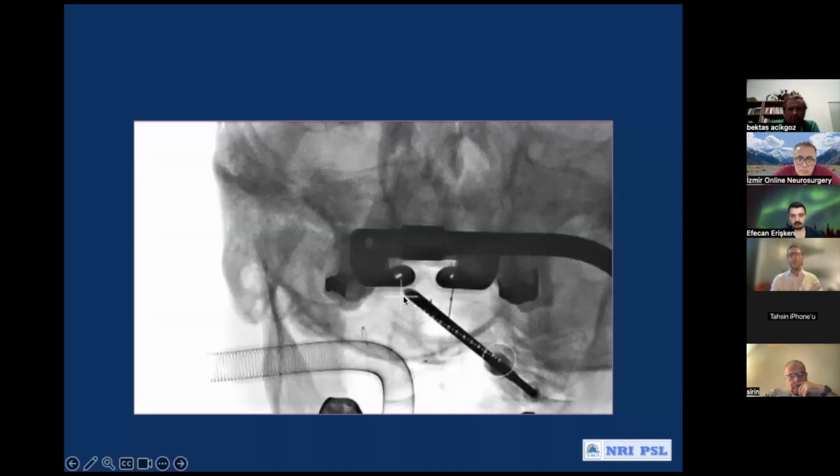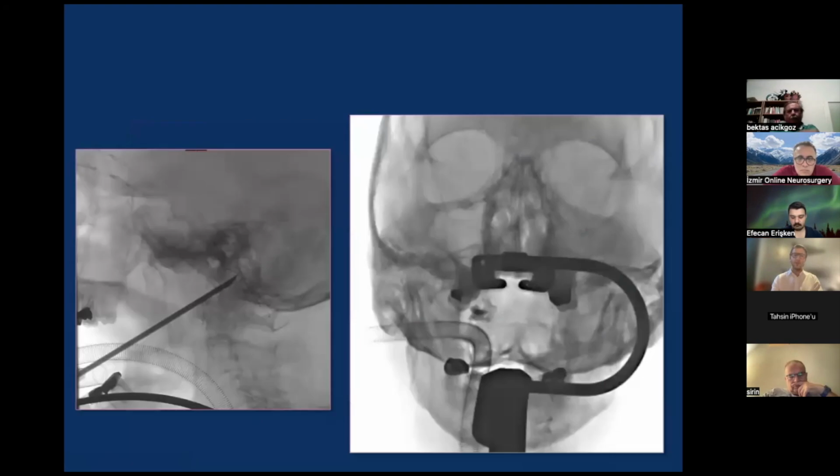And we will perform a CBCT acquisition, cone beam CT acquisition. On this acquisition, we will use the needle guidance, which will help to delineate the target to put the tip of the needle in the occipital condyle. So you can see here the positioning of the bone needle inside the occipital condyle.